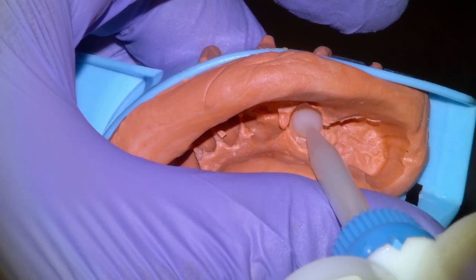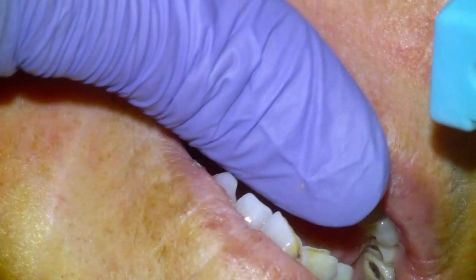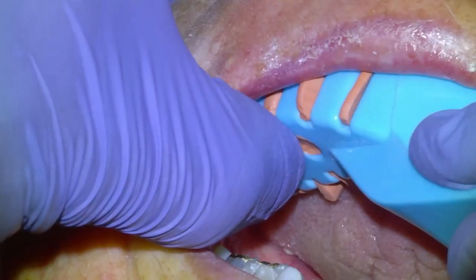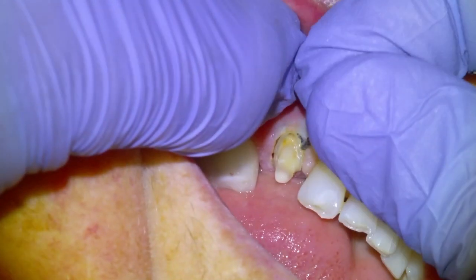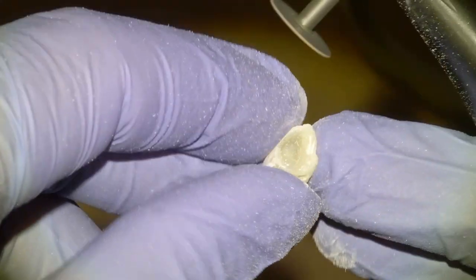Once we have taken our scan, we're going to temporize the tooth using the preliminary impression that we took at the beginning. We're going to load it up with our Integrity temp material and then seat the tray back in place for 60 seconds. After a minute we'll give it a wiggle and hope that it comes off — which it did in this case. We'll take the cord out, place a second cord in just the buccal aspect where it went subgingival, and then begin to shape our temporary with a coarse wheel soft flex disc until we're at the margins.